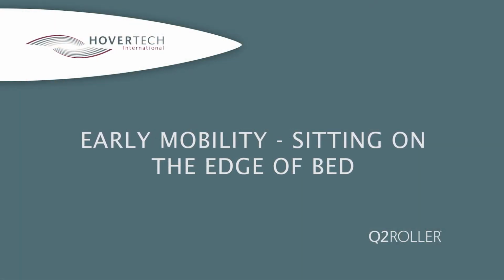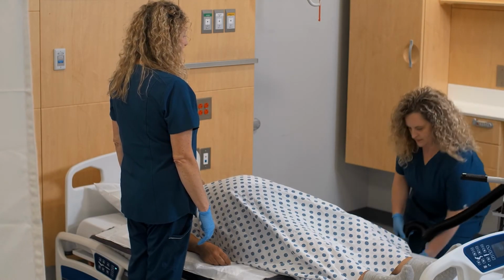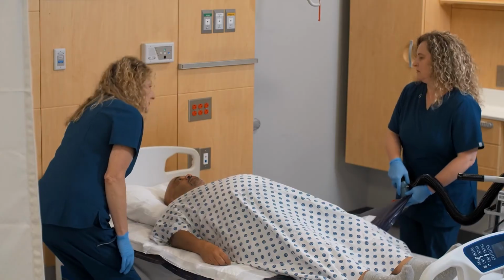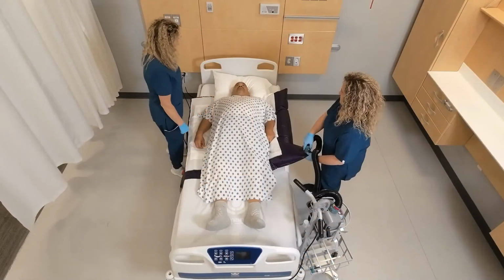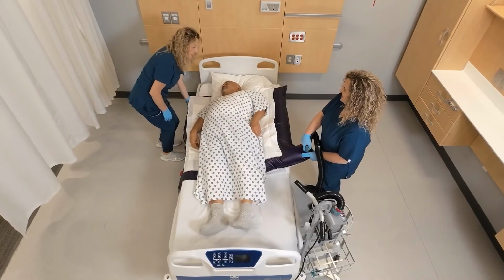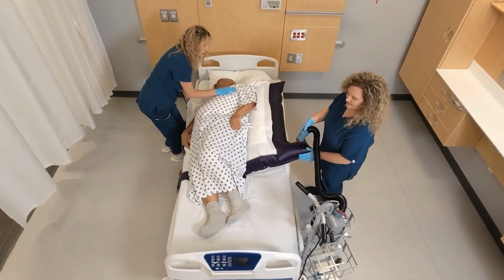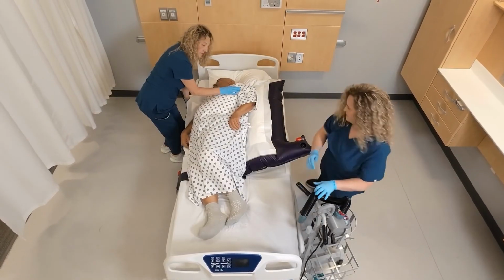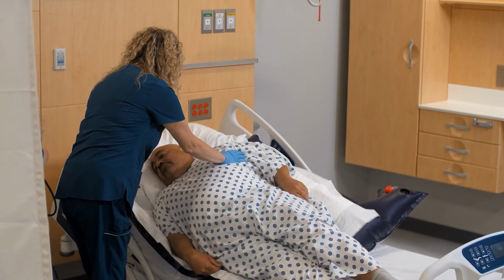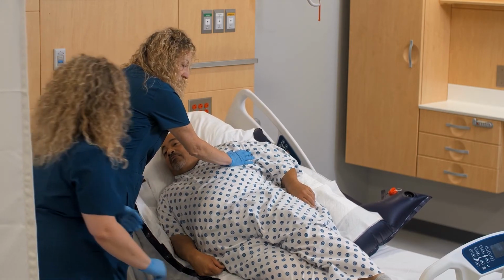To assist with early mobility, the Q2Roller can be used to sit a patient upright on the side of a bed. This technique requires a minimum of 2 caregivers. Start with the patient in a supine position centered on the Q2Roller. Bend the patient's knees to assist in turning. Fully inflate the first chamber using the adjustable setting on the air supply. Lower the bed so the patient's feet will touch the floor. Raise the head of the bed as far as it will go.